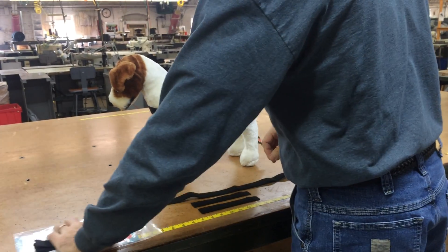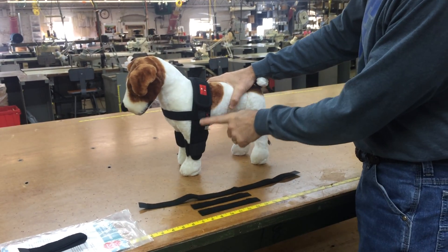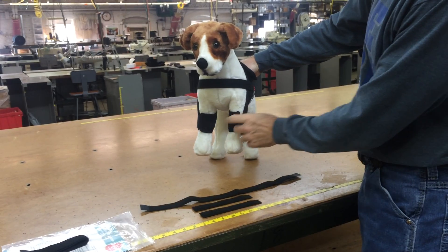It must be noted that the Shoulder Stabilization System must be used in conjunction with the Dog Legs Canine Protective Elbow Sleeve.